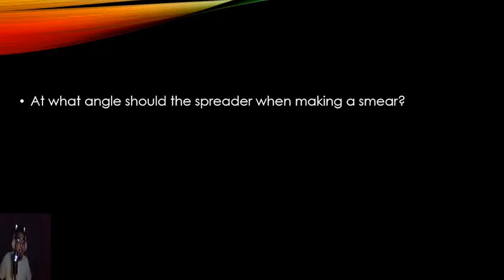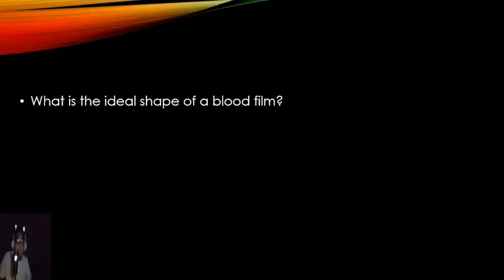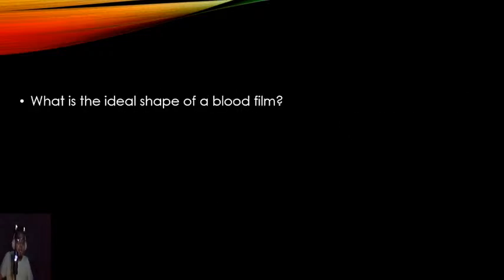It's 35 to 45 degrees. The ideal shape of the blood film is tongue shape.